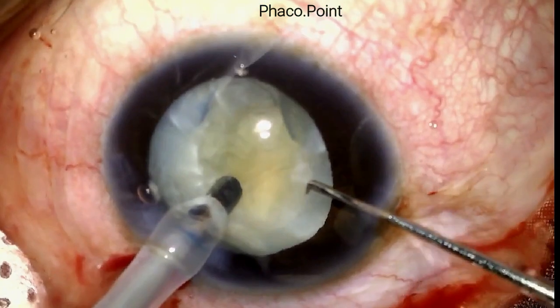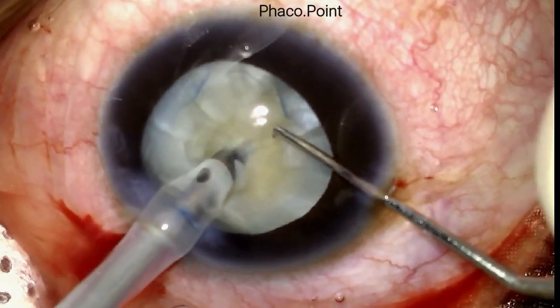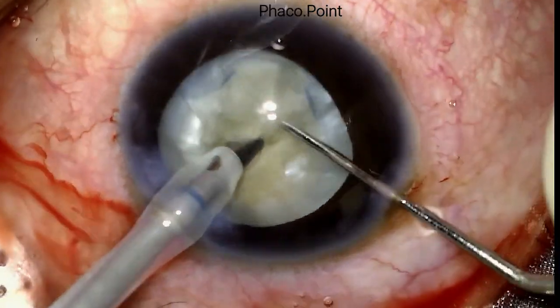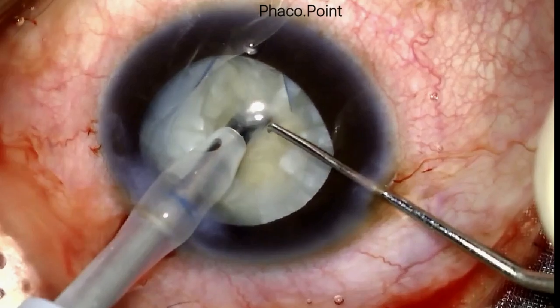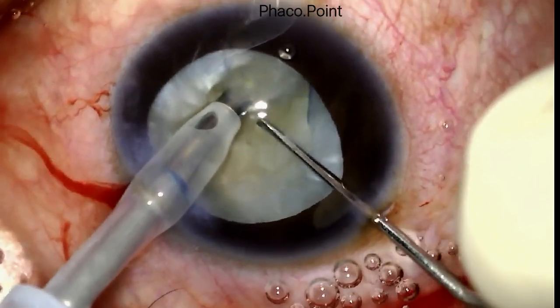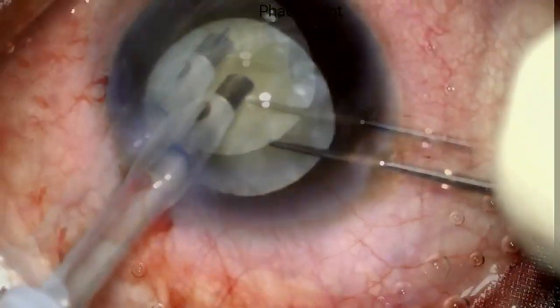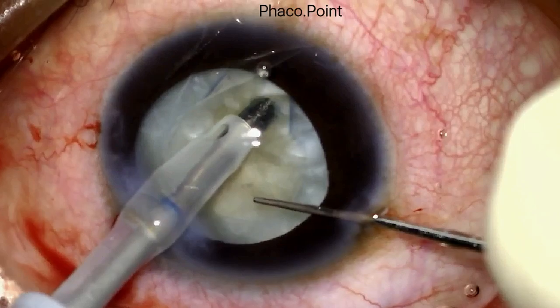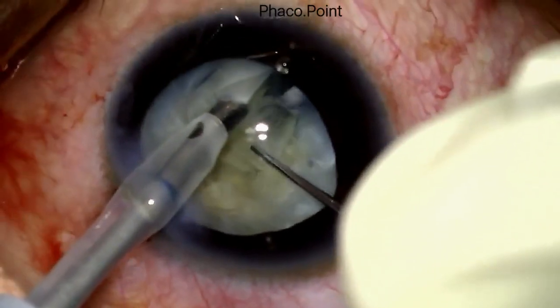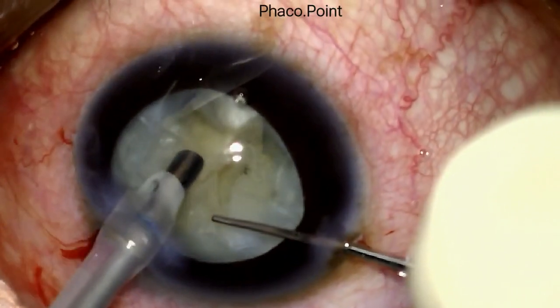The technique I will use is that of a direct vertical chop. I impale the nucleus and attempt the first chop to divide it — it doesn't happen immediately. I am careful not to perform excessive lateral separation that could compromise the tear in the anterior capsule. At all times I monitor how easily the nucleus rotates; as long as it rotates easily, I am sure I have not created any compromise in the capsular bag. I proceed to downsize the nucleus in a controlled, slow manner by creating multiple chops.